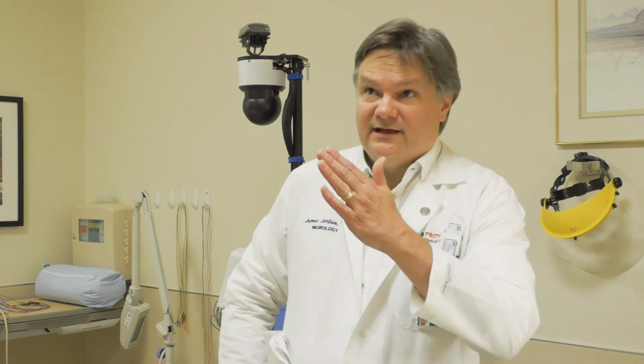And then the post-seizure assessment is sort of the same stuff you did during the actual seizure assessment. I start with memory, see if they remembered the strange adjective and noun that you gave them, whatever it was, blue elephant. And then see if they're oriented now. Note the time. If they're post-ictal, it might take them 5 minutes to get there, so you might have to keep reassessing to see when they actually come back online.